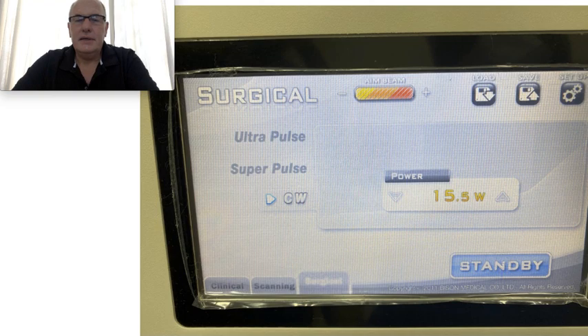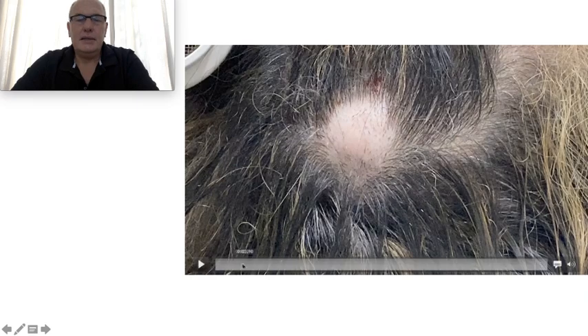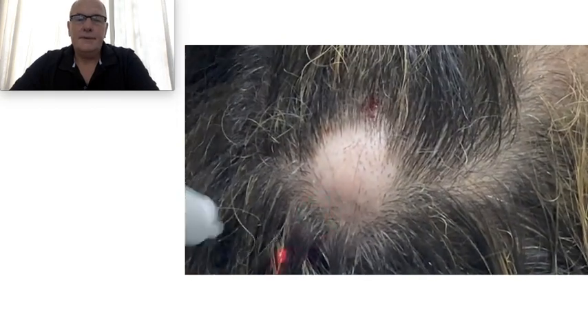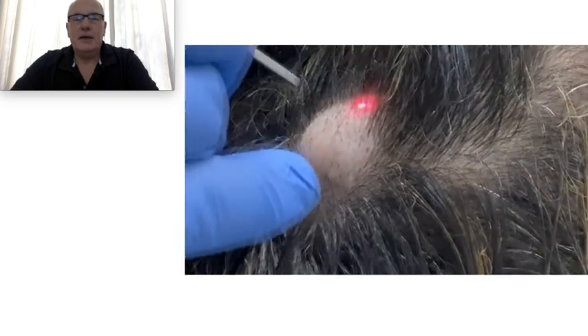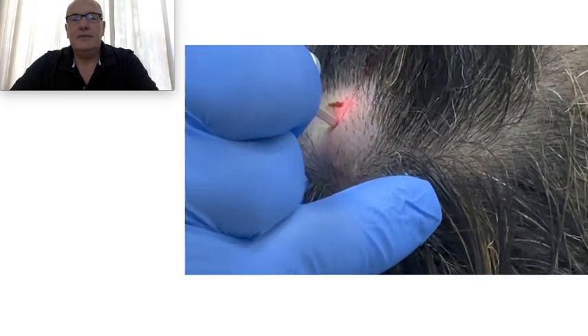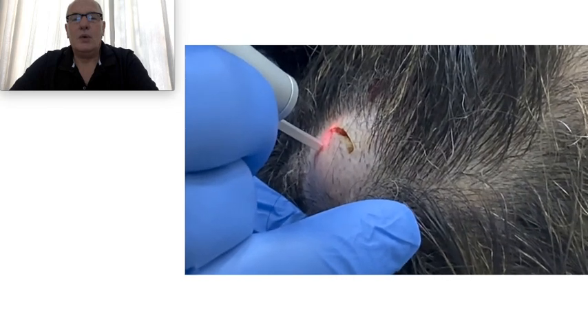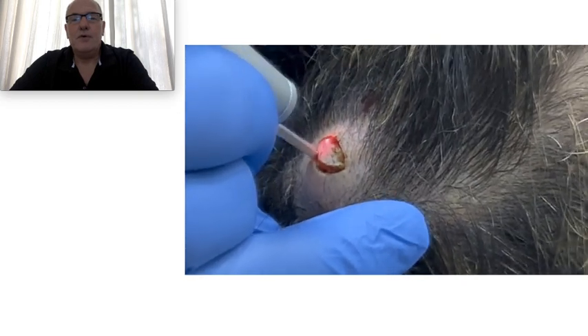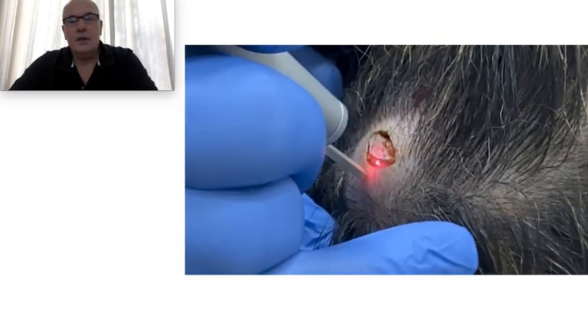My proposal is to make a minimal incision with laser technology. Here is the laser — it's in cutting mode at 15 watts. In this way I cut with the laser a small part of the skin. You can see the laser at work. I'm cutting the skin; the laser works at the foundation. This sound is an aspiration for the smoke.